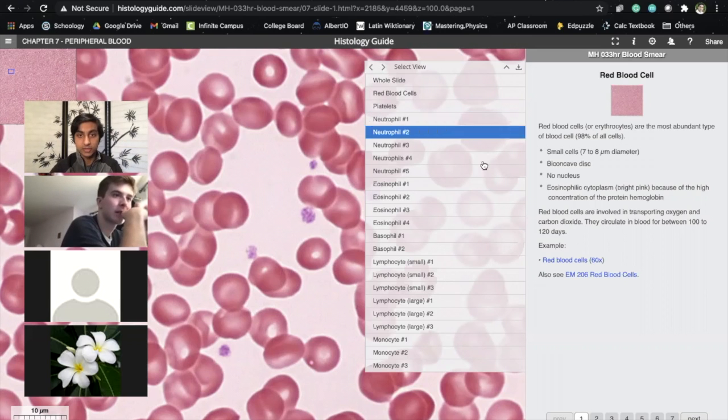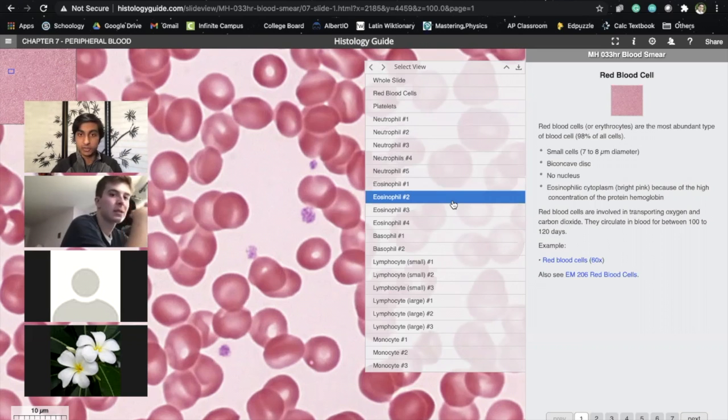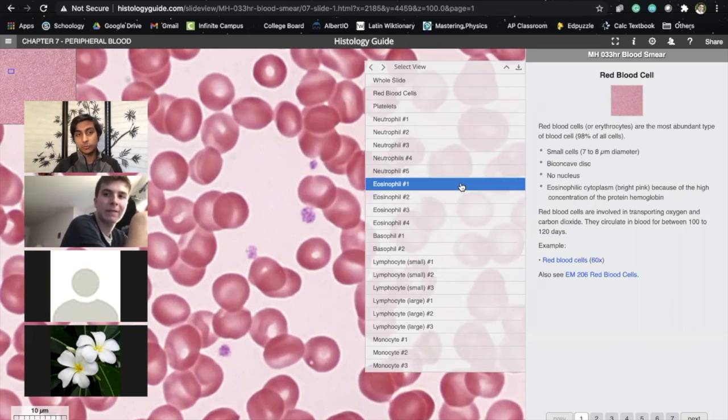And so the next thing on this list, and I'll show them in a moment, is the eosinophil. And that's actually what we looked at before. And what you'll notice is that these are, like I said, the granulocytes. When we look at it in a moment, you'll notice that they're filled with granules, little proteins that can eventually be released to cause inflammation, which is helpful in bringing a bunch of the necessary cells to come and kill an infection.